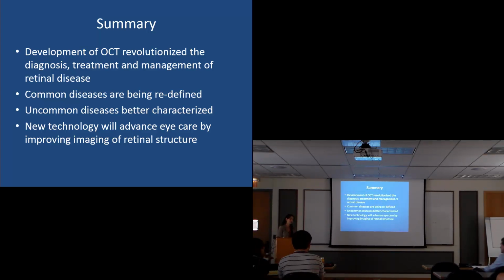So I didn't know if, in order to take multiple scans, would that be going over the exposure limit? No, I don't think we have an exposure limit that we know about with the eye. So it doesn't seem like it's exposure limit as far as toxicity, we haven't seen. I think it's really their challenge was just getting the reference, but they are doing it.